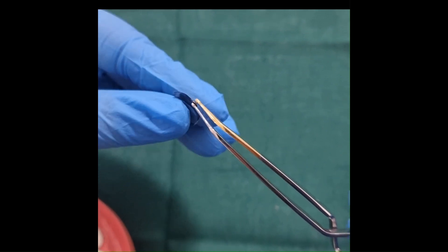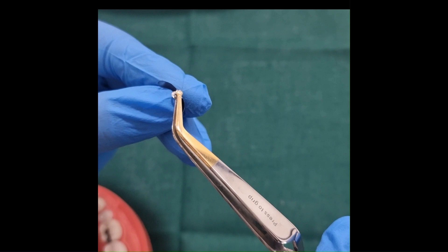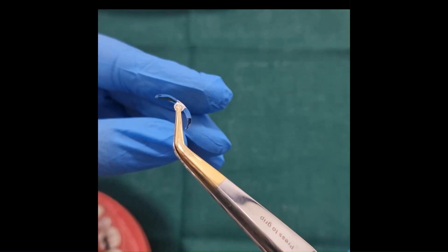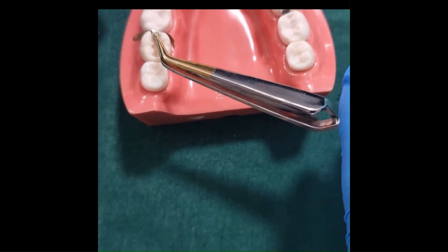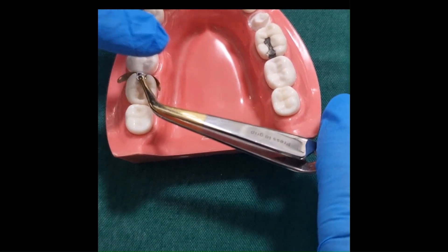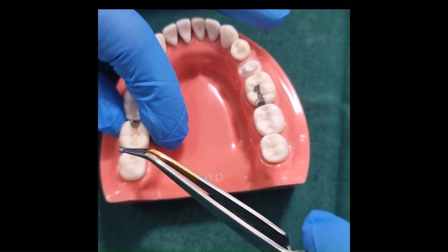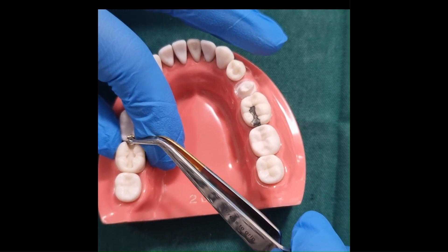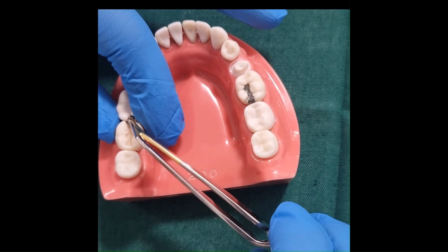Select the matrix and bend the matrix tab using the pin tweezer for easy placement. Secure the band in place using the fingers, and then bend the tab over to the adjacent tooth before restoring it with composite.